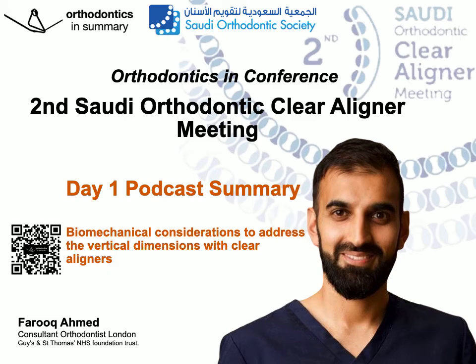He mentioned if large anterior IPR is going to be used, this can actually result in a deepening of the bite and creating premature contacts and those lateral open bites. And he described that actually extrusive movements are always underrepresented on the digital format. So he described having elimination of the occlusal interferences when it comes to refinement, but also not aiming for heavy contact on the anterior teeth.